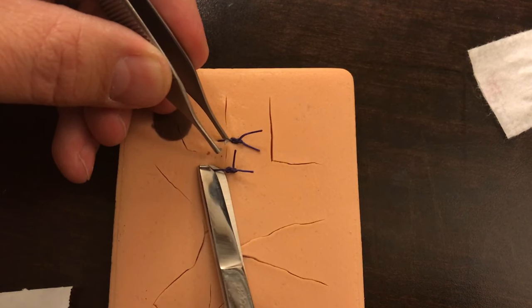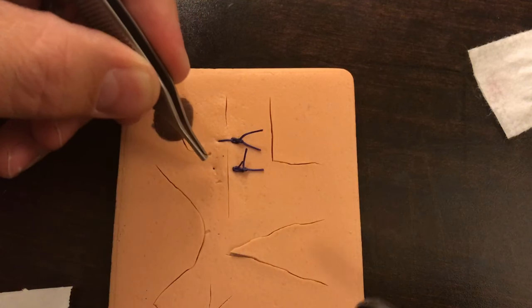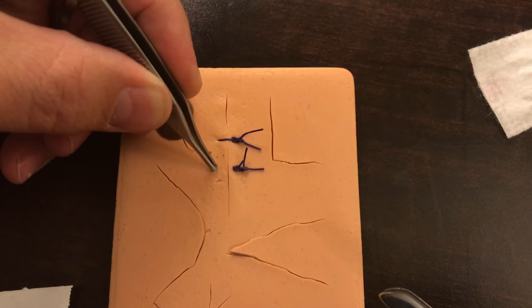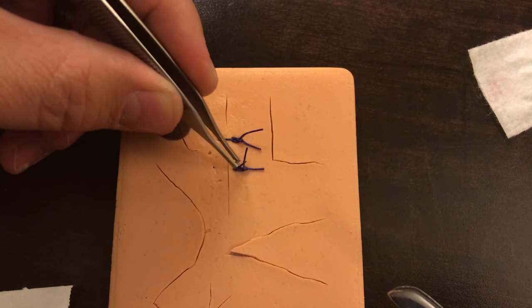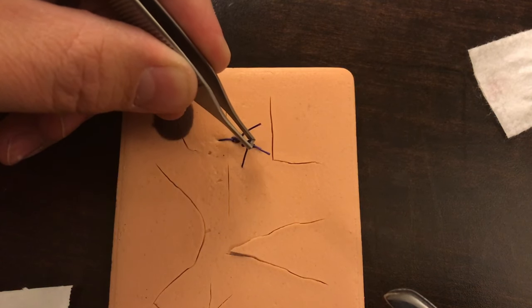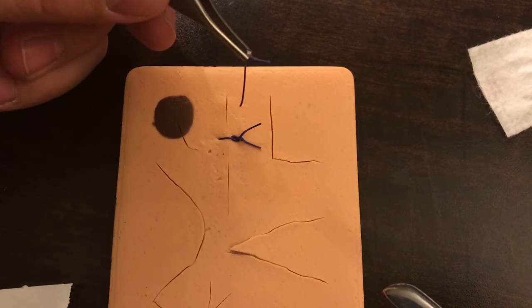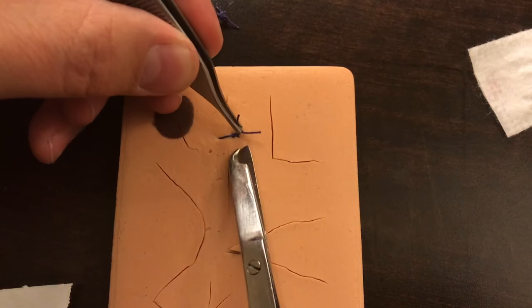For example, we could just sneak our scissor right underneath — be very careful not to cut the patient's skin — and snip right there. Notice I cut it and the part that was within the skin is still within the skin; the part that was draped over is now free-floating. As I pull this up, no part of the suture that was on the outside is being dragged through the patient's skin.